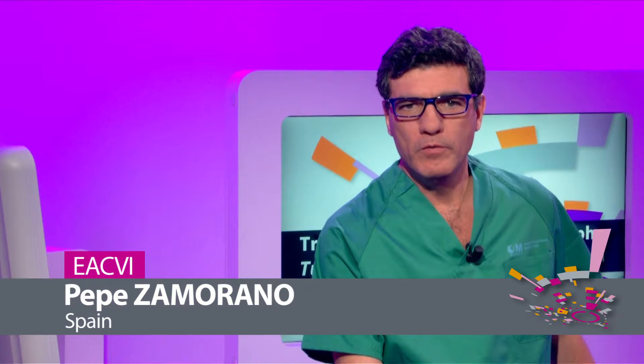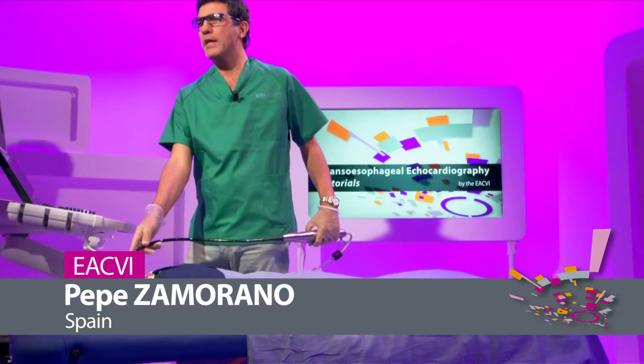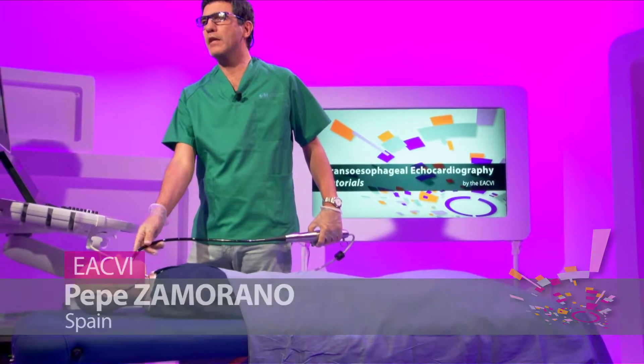We are going to show you how to use a transesophageal echo inside the cath lab in a patient that we are going to perform a TAVI on. There are a couple of very important things that the interventional cardiologists need to know before and also during the procedure.